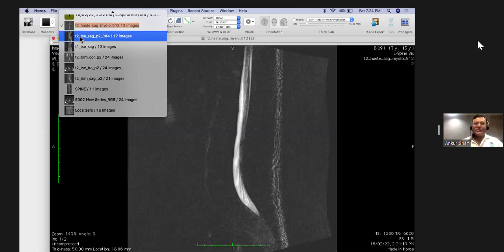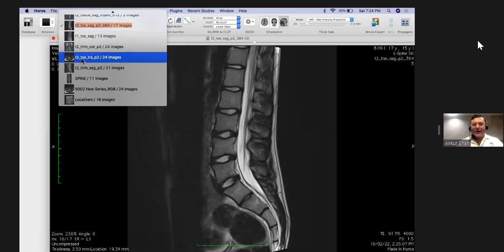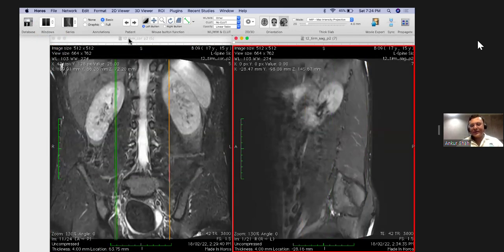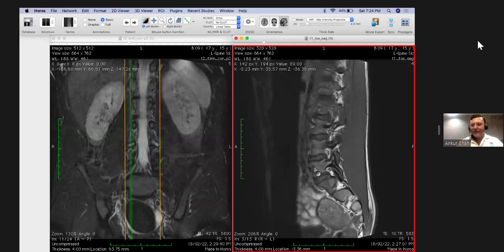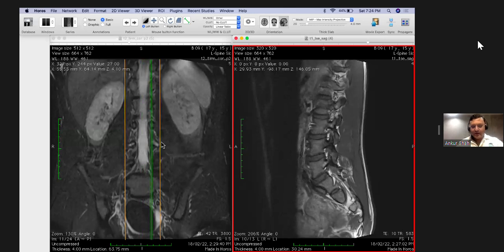So it is our responsibility to pick up those subtle areas of marrow edema at an early level so that we can advise them to take rest, to stop the activity for some time, and that will definitely help in healing of those areas of marrow edema. Usually in 4 to 6 weeks they heal, and then the player can go back to the sports. But if it is missed on the earlier scan and the player continues to play, they invariably end up having those fractures. Like here, if you see, it is involving both the pedicles at the L4 vertebral level.